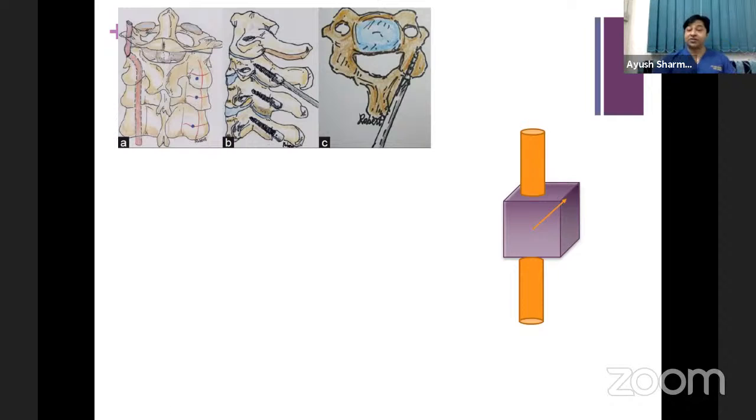the lateral mass. So if you want to put a bigger screw for whatever reason you choose, maybe in some cases we want to put the largest screw, maybe 16, 18 mm screws, then you can choose this trajectory. You can come down in the corner of the lateral mass and use the whole cube anatomy of the lateral mass to put big screws.